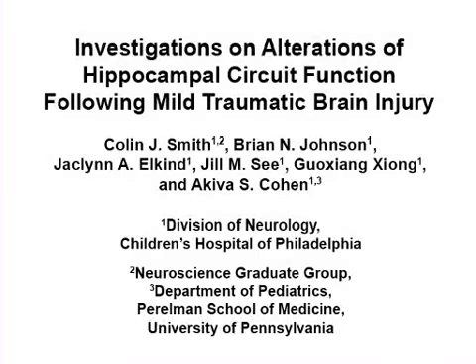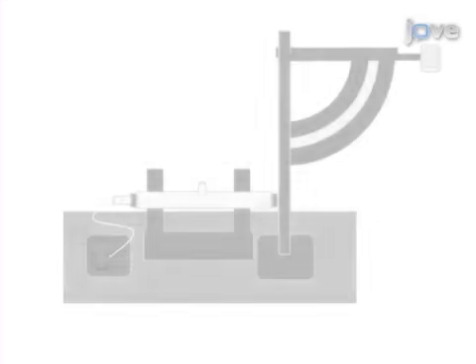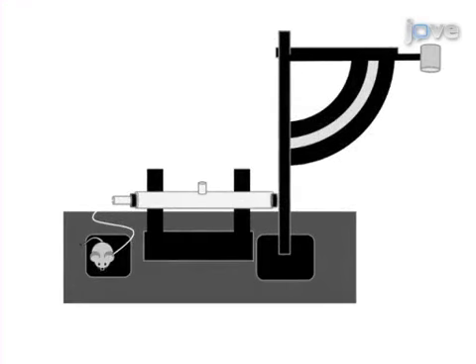The overall goal of the following experiment is to probe changes in network function of the brain areas affected by an experimental model of mild traumatic brain injury. Experiments begin by administering a lateral fluid percussion injury to a mouse, which mimics both the pathology and symptomology of human mild traumatic brain injury.